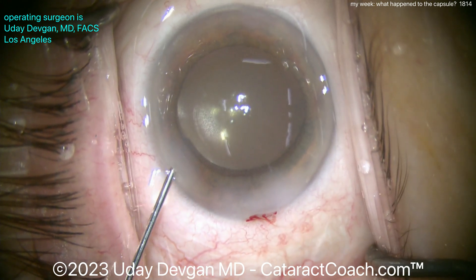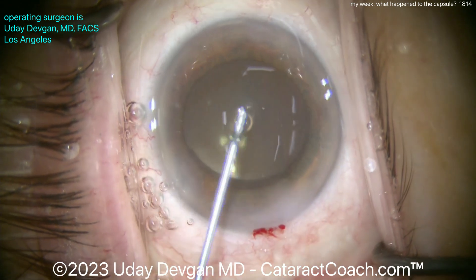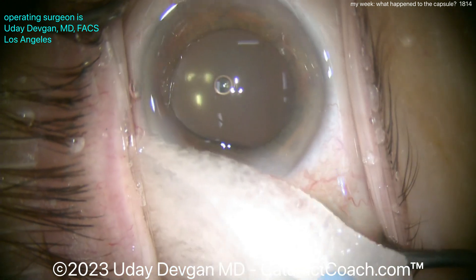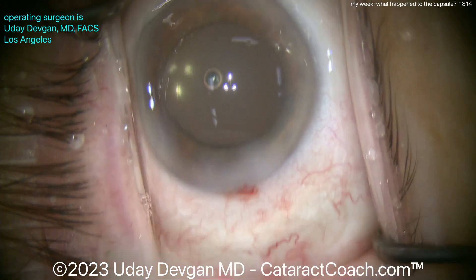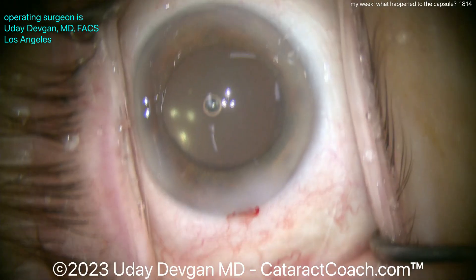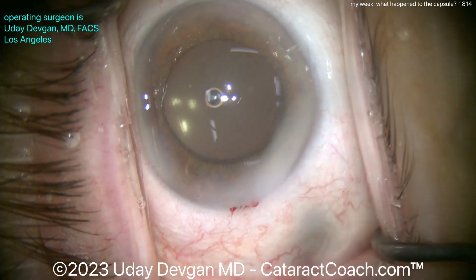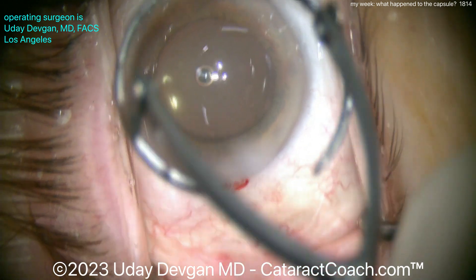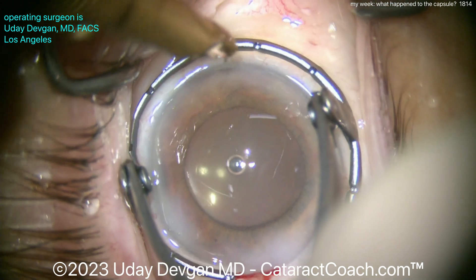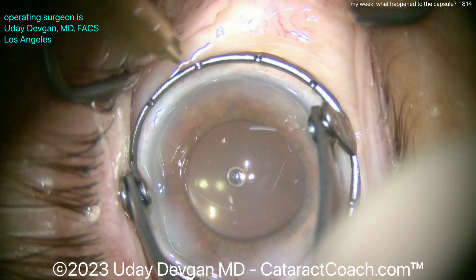Interesting case — you're going to see these ones too. That's why I tell patients: cataract surgery sounds routine, but every case is individual and there's stress involved. When your surgeon is hunched over the microscope, intensely concentrating — yes, it's five or six minutes, but it's a tough case. It's a 10-diopter lens, so you can tell this patient is myopic. I want to be extra careful not to break the capsular bag. A small limbal relaxing incision is also visible at the end.